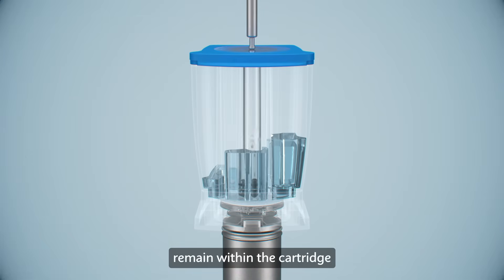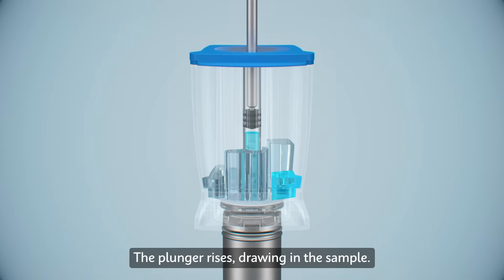All contents will remain within the cartridge throughout processing. A plunger lowers into the central tube, and the valve rotates to the first position. The plunger rises, drawing in the sample.